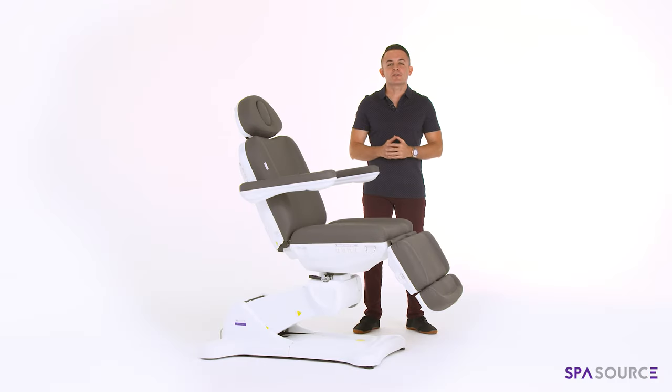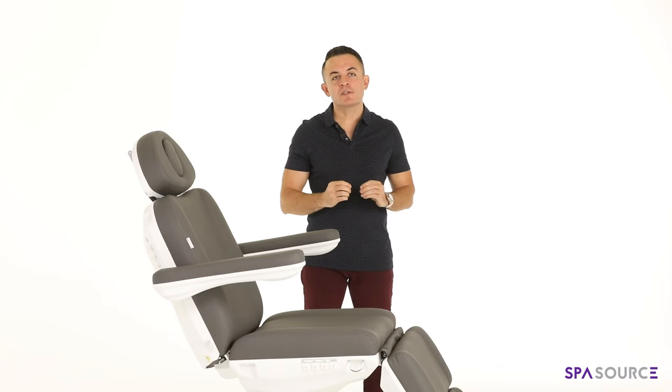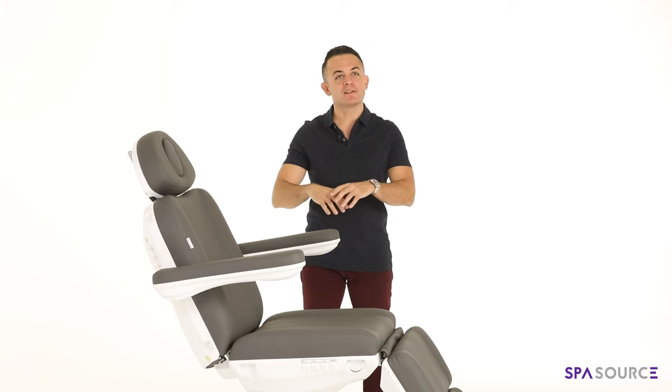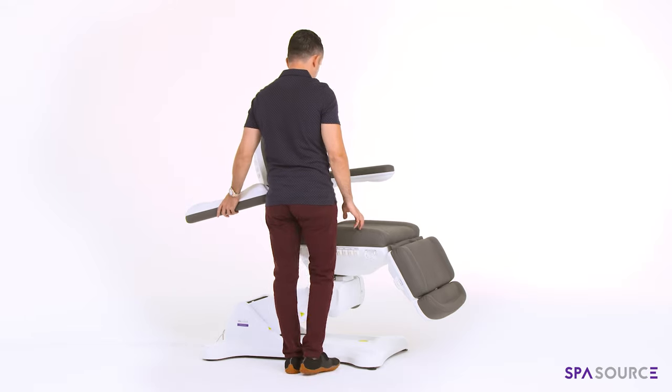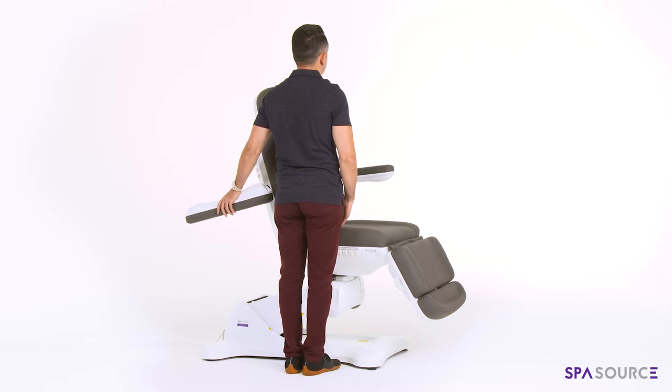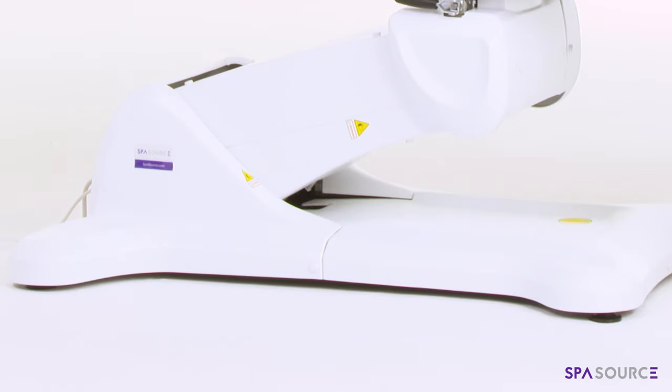Hi everyone, Alex here with SpaSource LLC giving you a quick demo of our fully automatic four-motor exam chair. One of the main reasons a lot of our clients gravitate towards this platform is the way the base is designed — it's very tapered, which means if you're giving the kind of care that requires you to be extremely close with the patient, this might just be the platform for you.